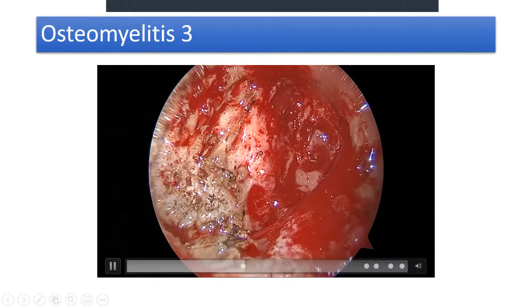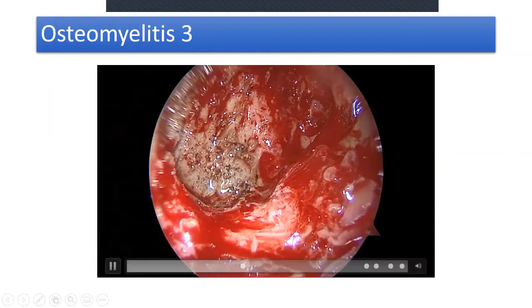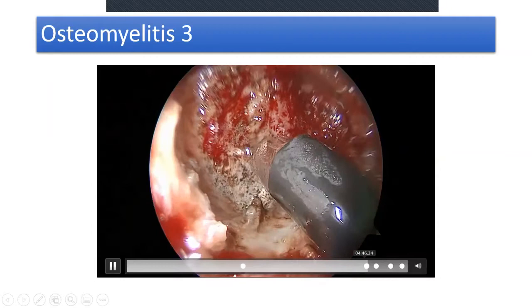Taking the coblator and clearing the mucosa further to expose whatever porous bone is left, scraping it off — most of it cleared.